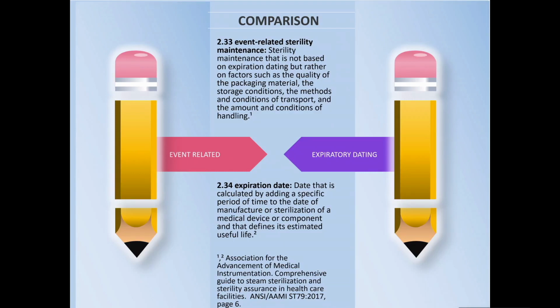Rigid containers didn't exist back then, but for those two kinds of packaging materials, we had to check every out date, take them down, tear them down, as we would say, and repackage them and re-sterilize them, and of course, redate them.